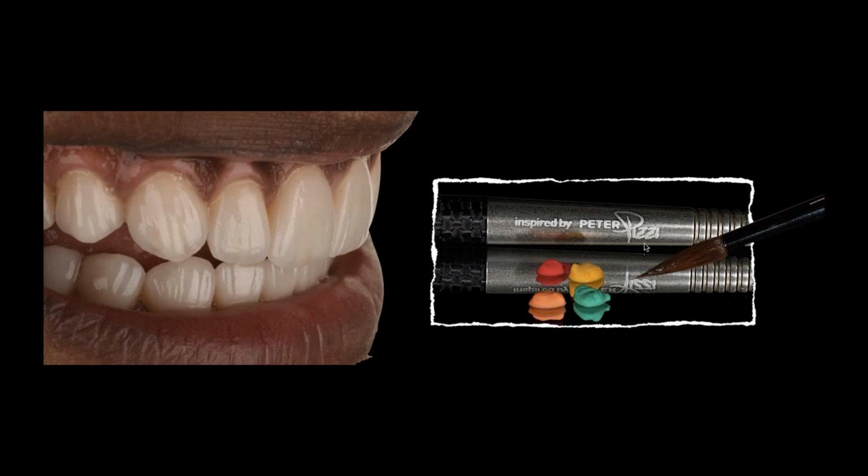But I also want you to be clear, it's not just the incisal edge, it surrounds the entire tooth, which means you usually need more than one halo material, because cervically I want chroma, middle third I don't want as much, and then as I get towards the incisal edge is where I get the brighter and whiter. You can do it with stain, a little on the cheaper side, I would argue, so try to do it with your powder buildup, it's better.